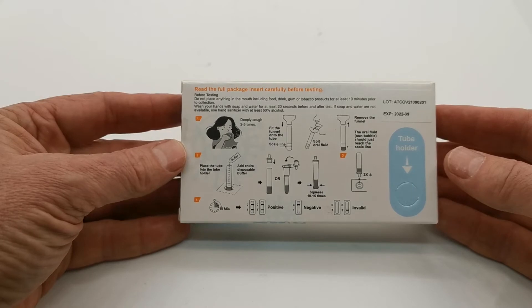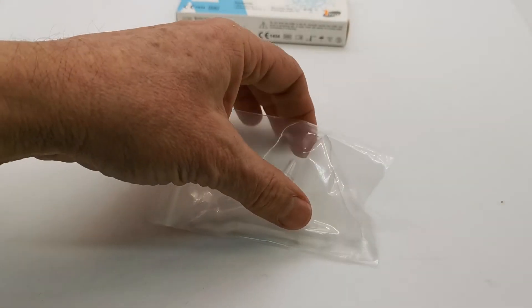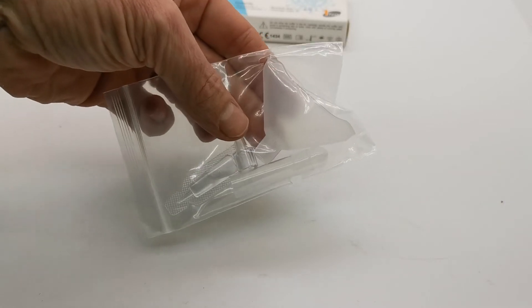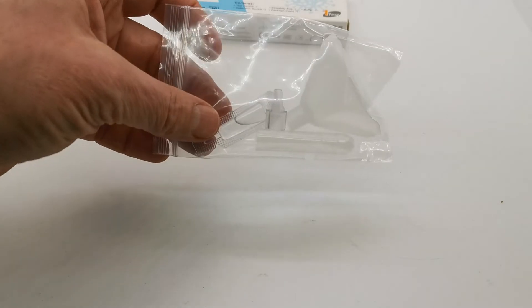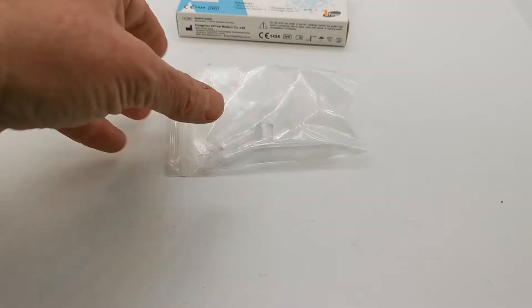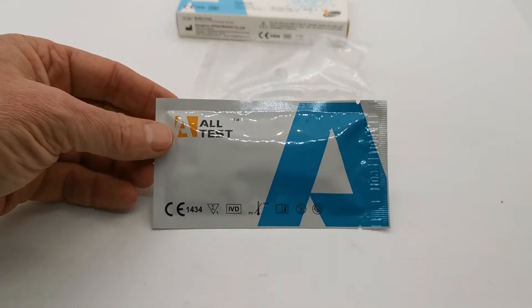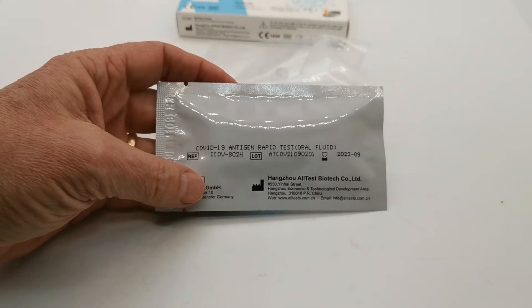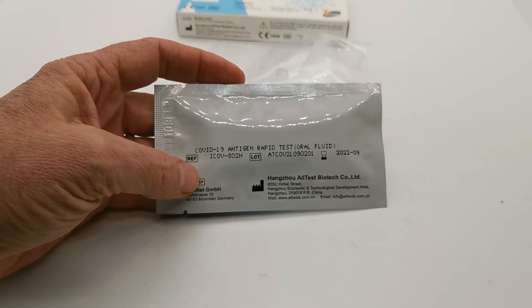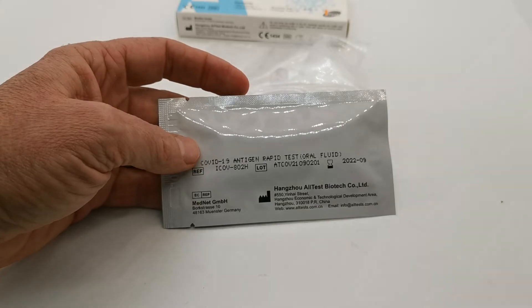When we open the pack up, let me show you the contents. What comes with the pack is a little collection funnel for the oral fluid, a vial for actually running the test in, a sachet of buffer, and the test cassette itself, which comes in a standard All-Test foil. On the reverse you'll see the CE certification guidance for the COVID-19 antigen rapid test oral fluid.